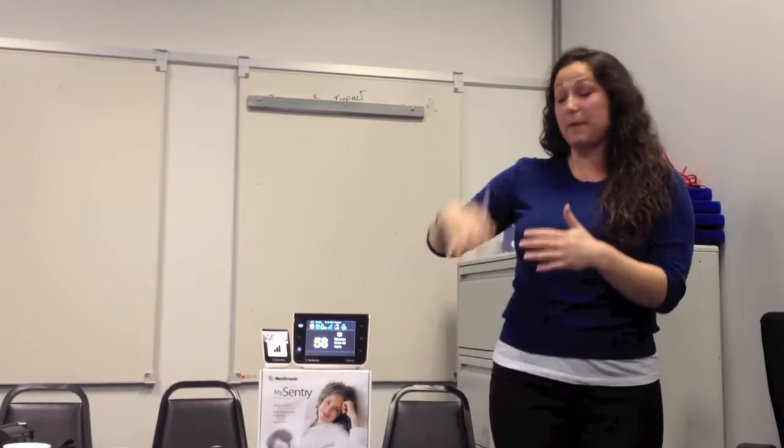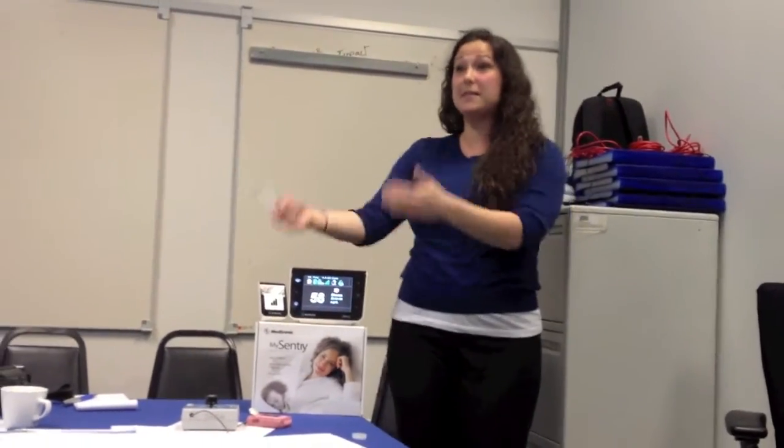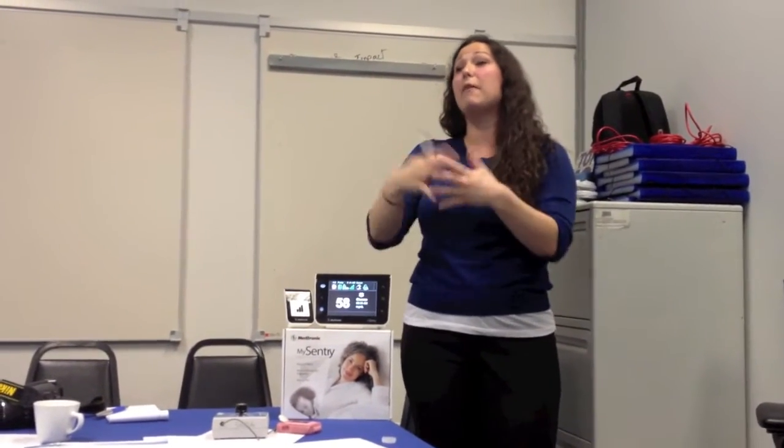So hypothetically, if you don't change your sensor, it'll react however your pump is going to react, because this is getting the information from the insulin pump. Whatever is displayed on here is coming directly from the insulin pump. So if you restart it on the pump, it'll restart there, right? However your insulin pump is behaving and whatever's showing on there will be recorded here and show on here.